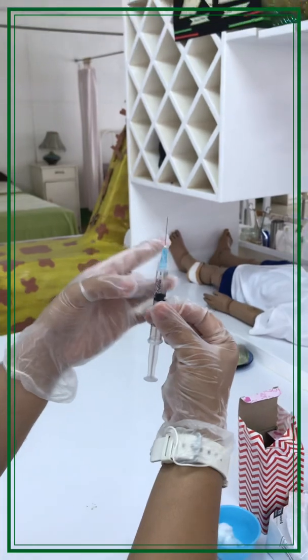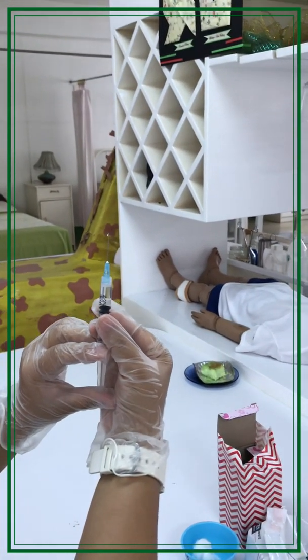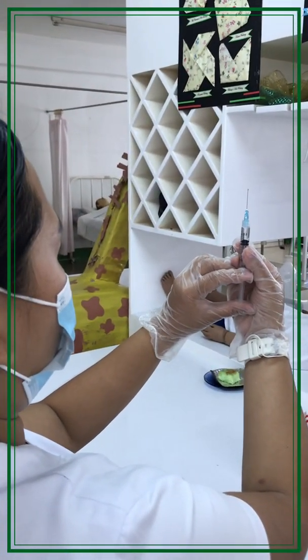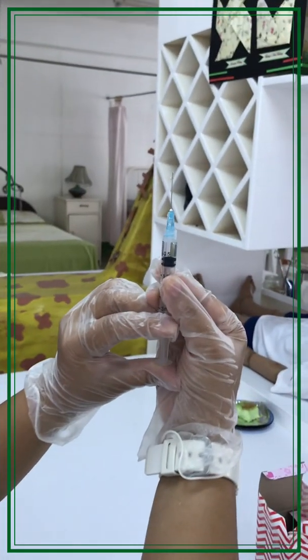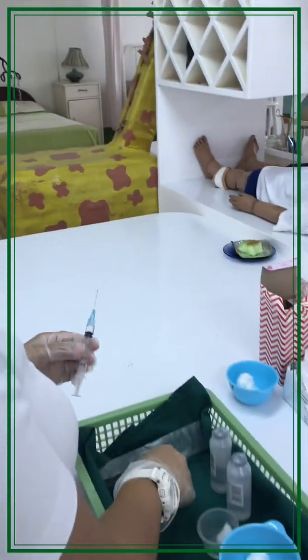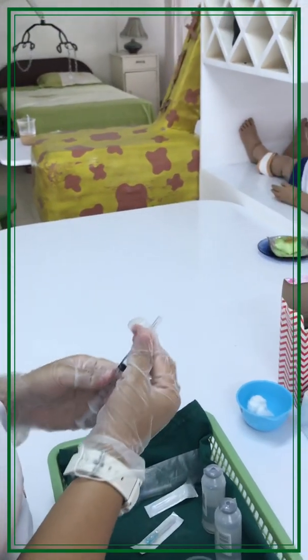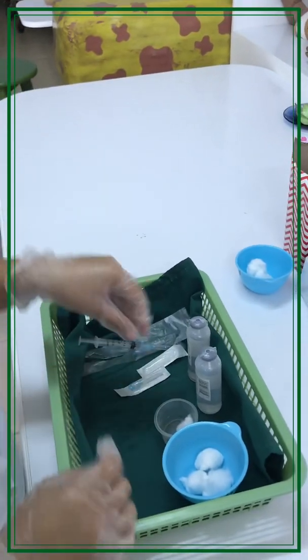Take the bubbles out of the syringe and flush out any excess medication. The medication is now ready to be administered.